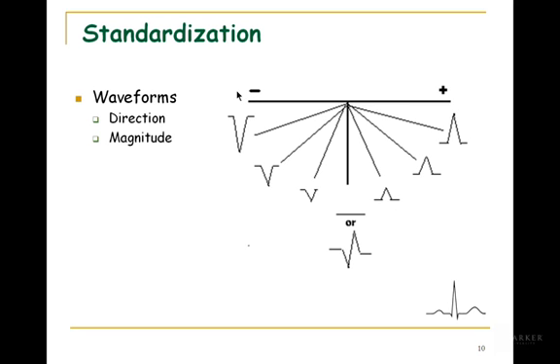But before we even do that, let's first say, if that wave of depolarization happens to be running towards the positive recording electrode, your deflection will be upright. So that's standard. If the average direction of current flow is running towards the positive recording electrode, you're going to have an upwards deflection. If it happens to be running towards the negative recording electrode, you'll get a downwards deflection.